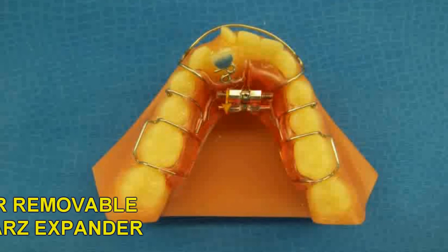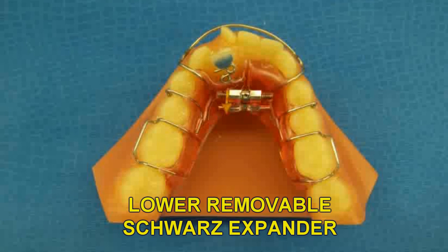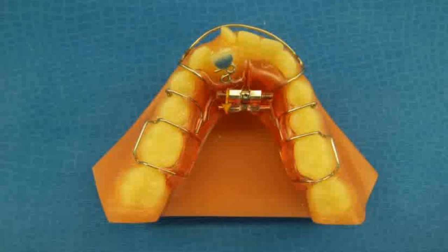The lower Schwartz appliance is about your only option for a removable expansion appliance in the lower arch. It works very nicely to expand the arch to uncrowd the teeth and also helps to upright the posteriors as well.